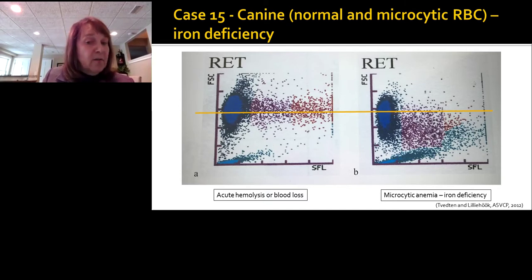And you can ask yourself, do I have problems with any of my other counts? You might say I could have a problem with a platelet count. You might want to evaluate that simply because those new cells are so small in this animal. So again, an enhanced flagging.